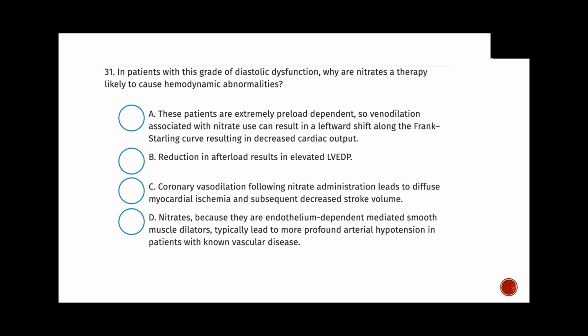And then lastly, I'll leave you, there's no more questions. Diastolic dysfunction is very complicated. Even for cardiologists who are reading echoes all the time, it is a very complex field. I tried to simplify it as much as I can for you. You're going to have to look at this stuff a couple times repeatedly, but if you simplify it as much as possible, know what your mitral valve inflow patterns are, know what your tissue Doppler patterns are and why they look like they do, know your E to E prime variables, and just take a look at those algorithms, and you're going to ace it, no problem.